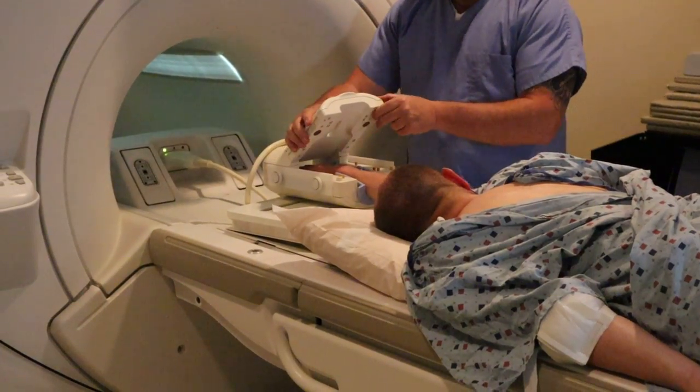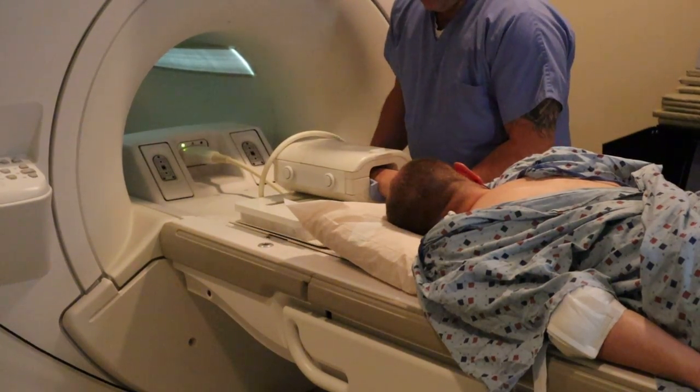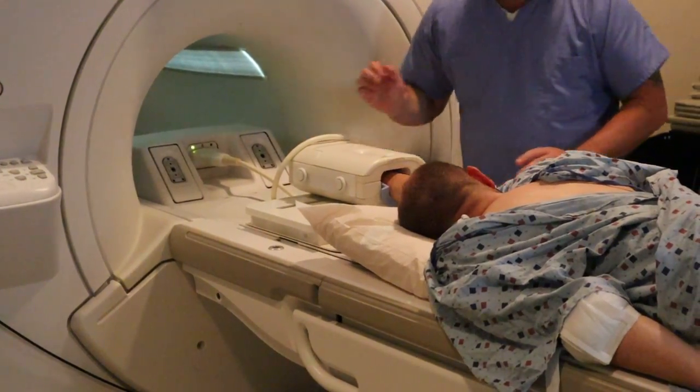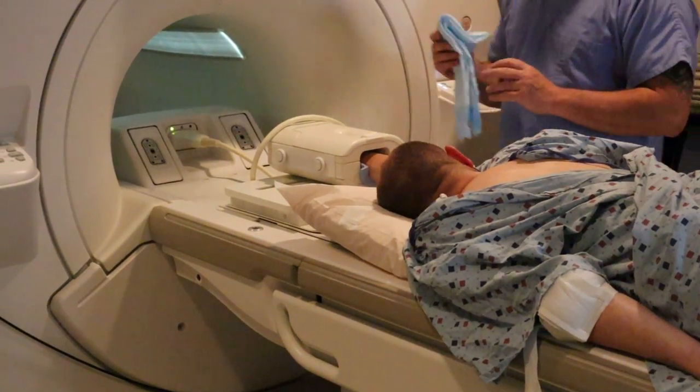You're going to align at the mid-carpal plane, and you want to ensure that the coil is dead center in the bore. That's going to ensure optimal signal.